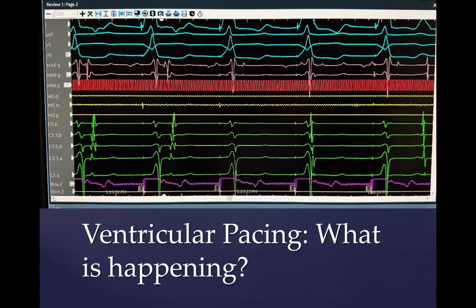And so now one could have just put the catheter into that location based on the CARTO map and burned there. But instead, what we did was we waited about 3 or 4 minutes, and the pathway came back. We went back to that area and determined that maybe a millimeter lateral to where it seemed to go away on the CARTO map was the better spot. You have to remember that we cannot tell where it went away between this beat and this beat. All we know is it was here on this beat and gone on this beat.